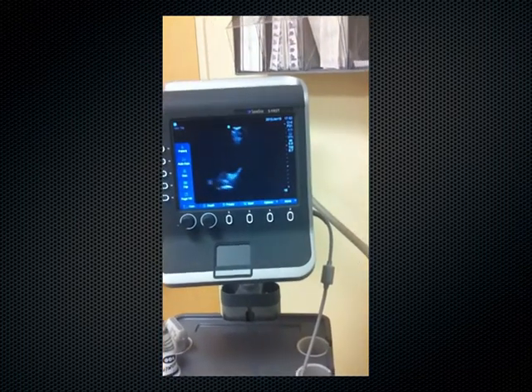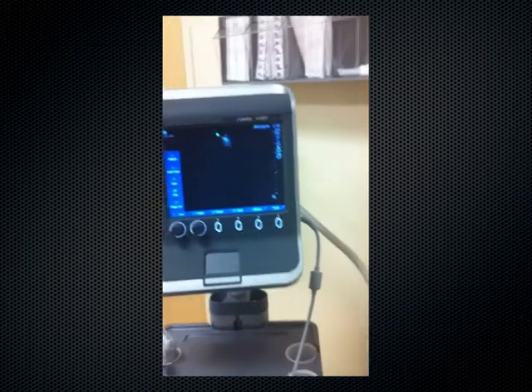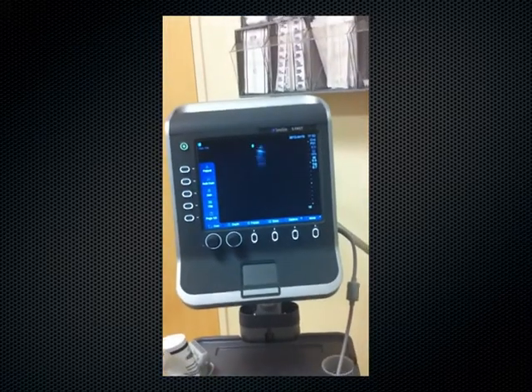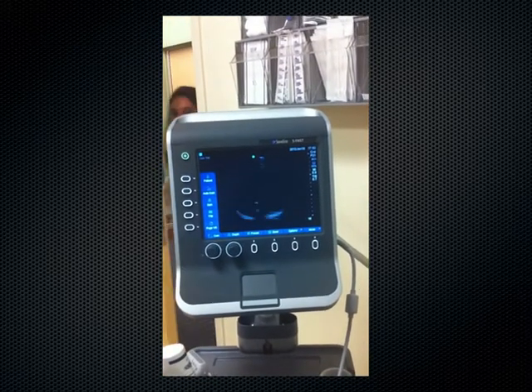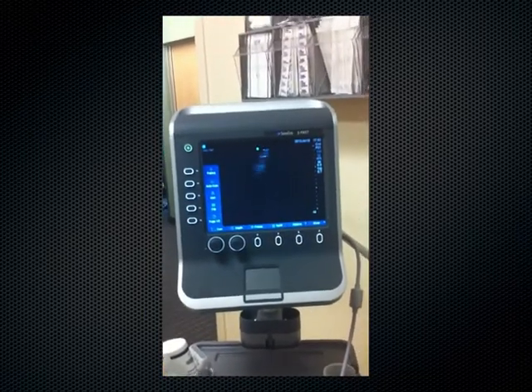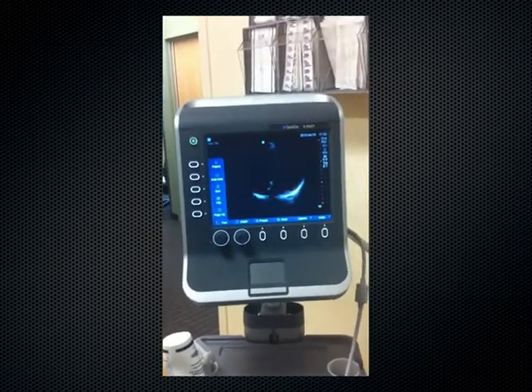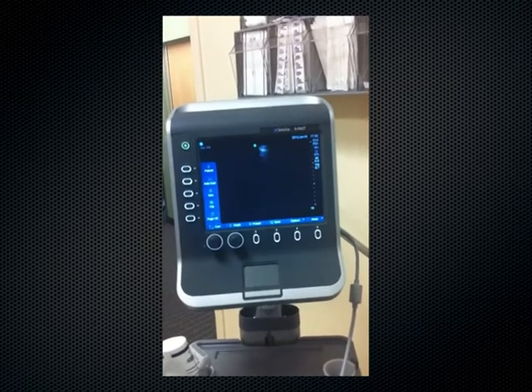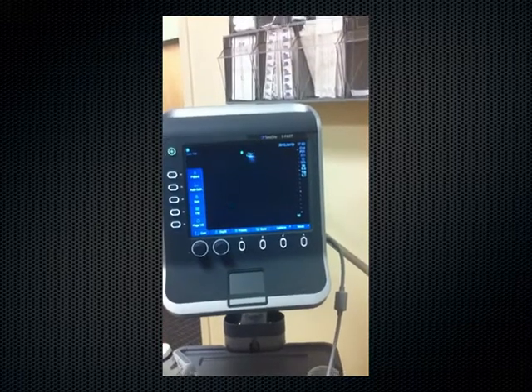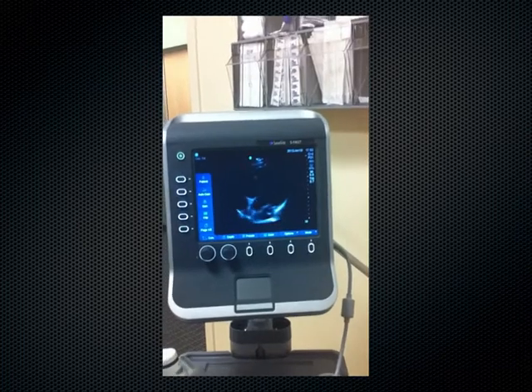Yeah. I'm going to take off. Okay. No. I know you're outside. I had to listen in a little bit to make sure I wasn't on. So we had the patient, Kevin, where'd your heart go? We had the patient go left. It's still on there somewhere. So we could cut out that segment where we're trying to find it. There you go. That's good. There. Yeah, perfect. Okay. So now continue.